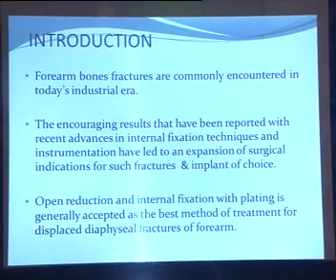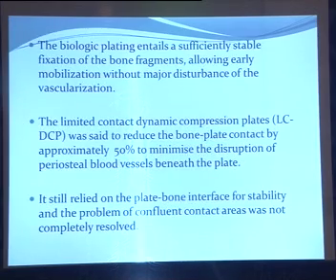Coming to the introduction, forearm bone fractures are commonly encountered in today's industrial era. The encouraging results that have been reported with recent advances in internal fixation techniques and instrumentation have led to an expansion of surgical indications for such fractures and the implant of choice. Open reduction and internal fixation with plating is generally accepted as the best method of treatment for displaced diaphyseal fractures of the forearm. The limited contact dynamic compression plate was designed to reduce the bone plate contact by approximately 50% to minimize the disruption of periosteal blood vessels beneath the plate.